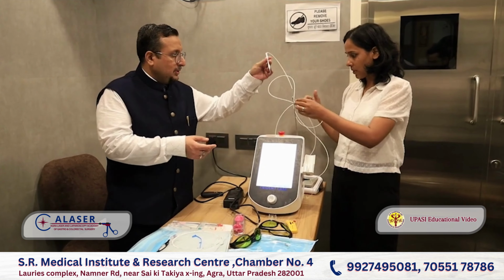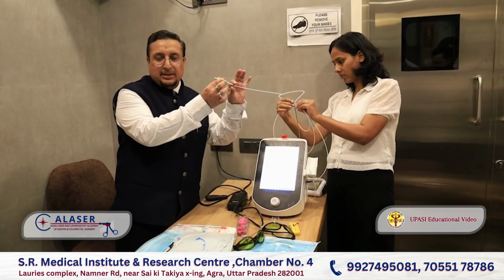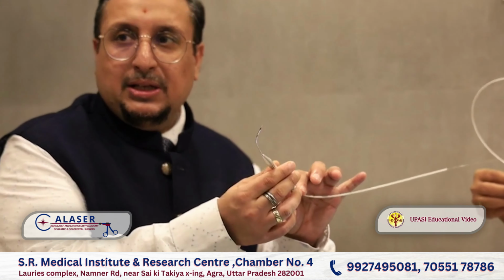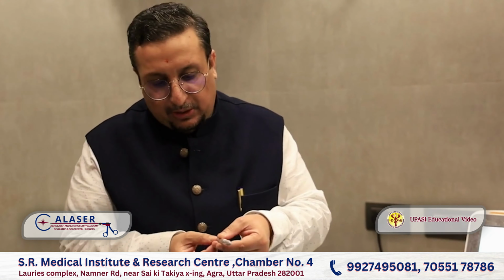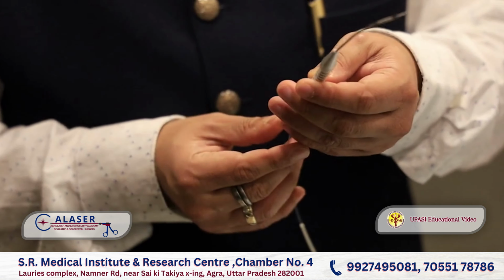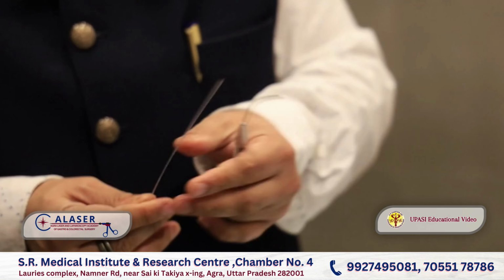So this is a bare. So this is the handle, right? This is the piece, hand piece. So this hand piece goes inside the tissue with the fiber, right? So we have to put the fiber in the hand piece. This is the bare fiber. So this bare fiber, if I show you, this is the bare fiber.